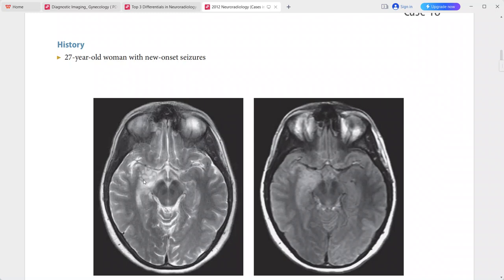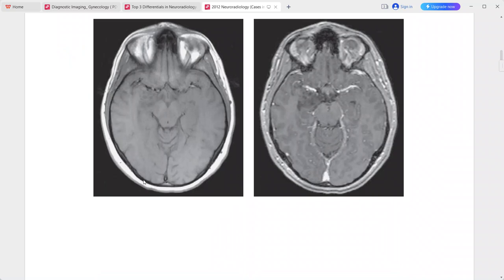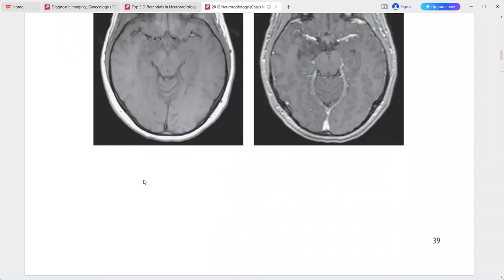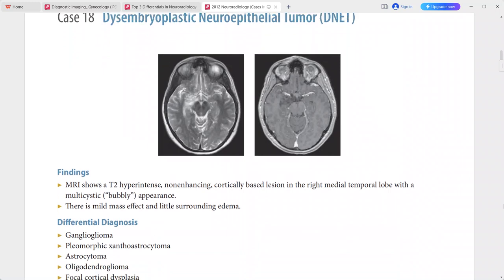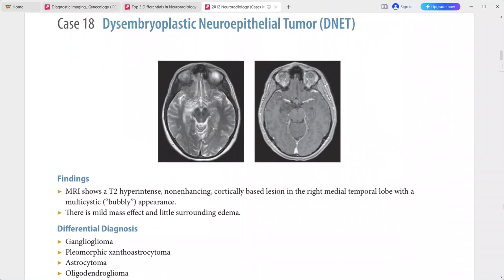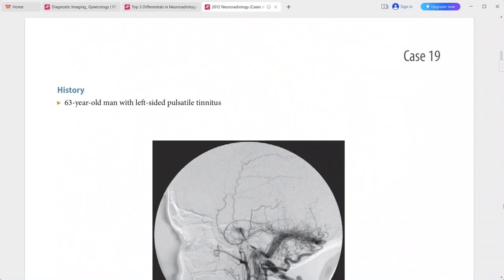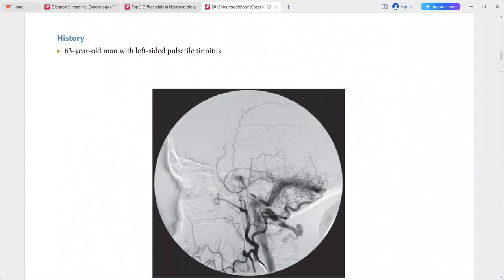The main differential is DNET (dysembryoplastic neuroepithelial tumor). Other differentials include ganglioglioma, pleomorphic xanthoastrocytoma, astrocytoma, oligodendroglioma, and focal cortical dysplasia.